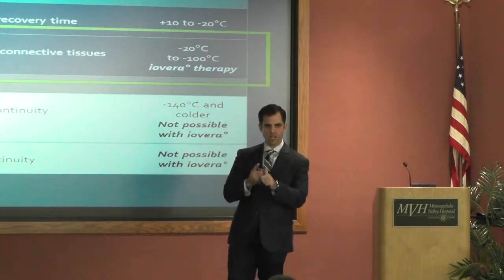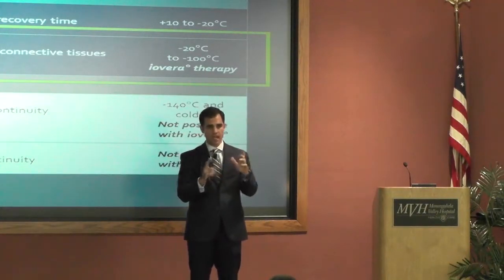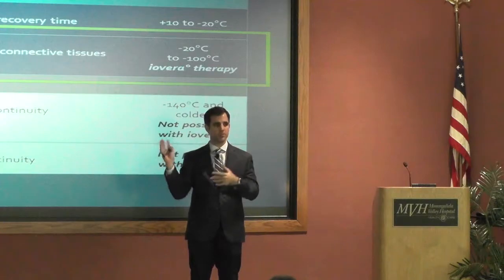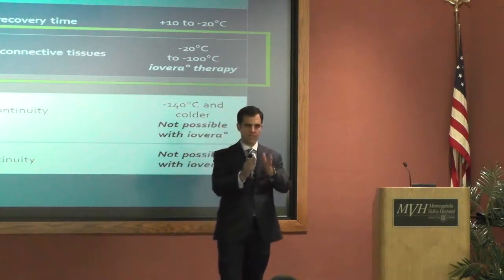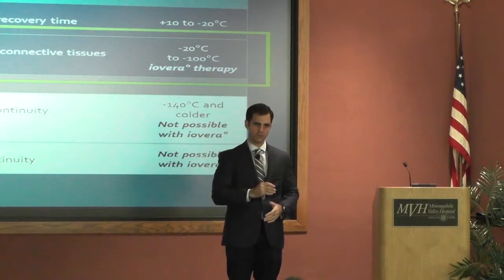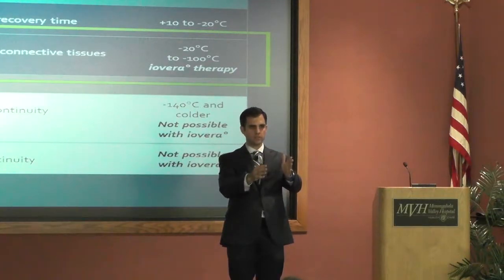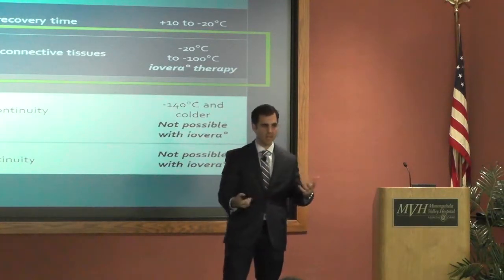So that's where using the ultrasound can help, because you can see the nerves. And even if some people don't use an ultrasound to identify the nerves, you treat a larger area so that you make sure you got the nerve. You treat across a bigger area, because it's going to be somewhere in that area. That's just how we're made up.